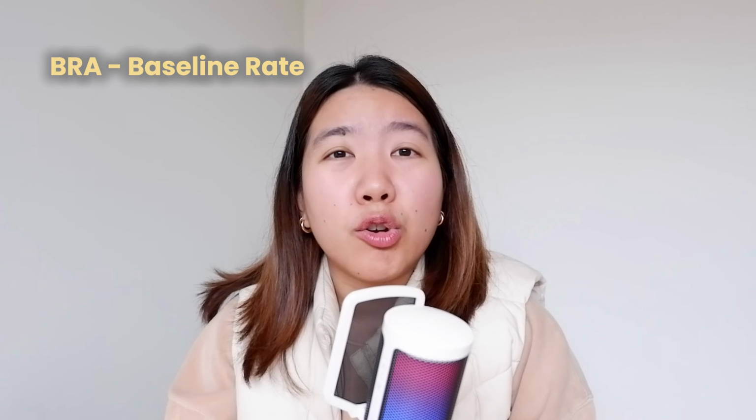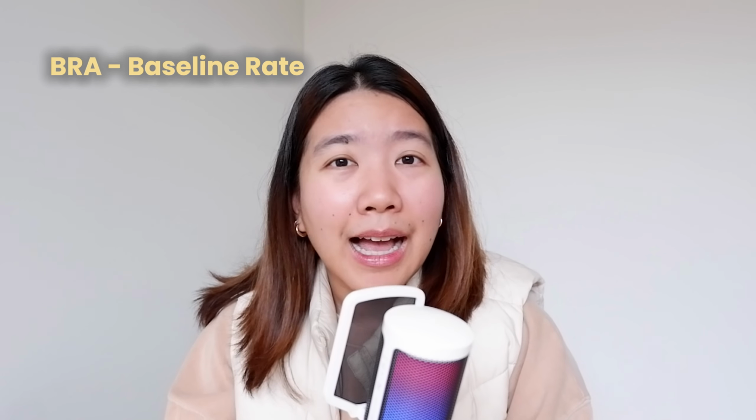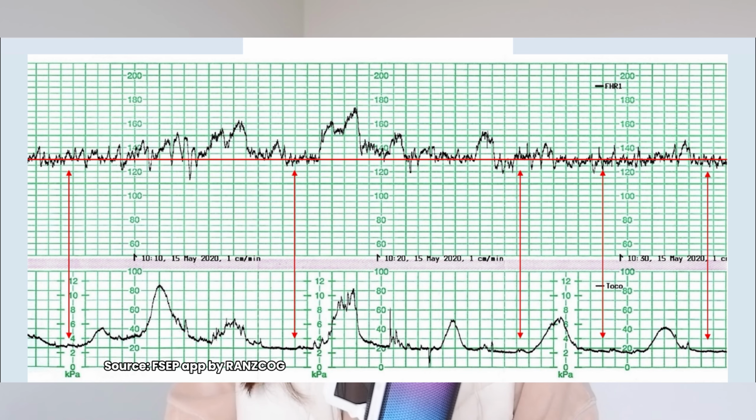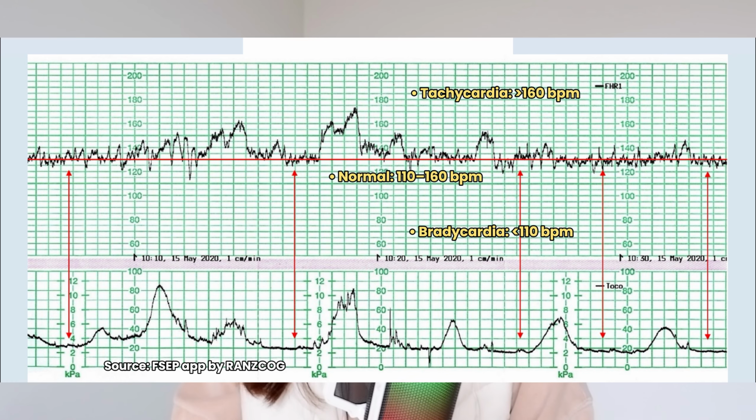Baseline rate. When you look at the fetal heart rate baseline, the appropriate part to look at is when the environment settles, with no contractions or other stimulations. The normal fetal heart rate in Australia is 110 to 160. If it's above 160, it's called tachycardia. If it's below 110, then we call it bradycardia.